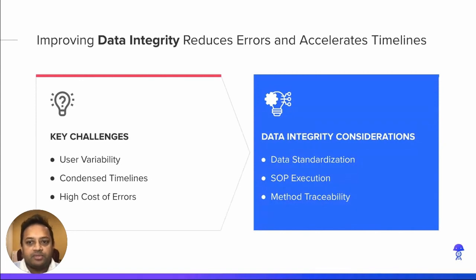So bioanalytical teams contend with significant project load with condensed timelines as they support key GXP study readouts. Teams want to minimize user variability in processing and analysis of biological samples that often originate from expensive preclinical or clinical studies. Data integrity becomes extremely important against this backdrop in ensuring accuracy and reliability of bioanalytical data generated.